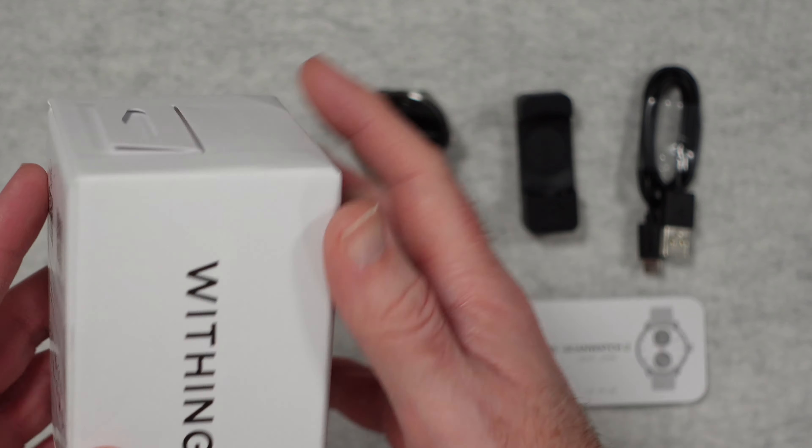Now this is flashing a little bit on the camera but it doesn't flash in real life — it is a steady display and a very clear display as well.